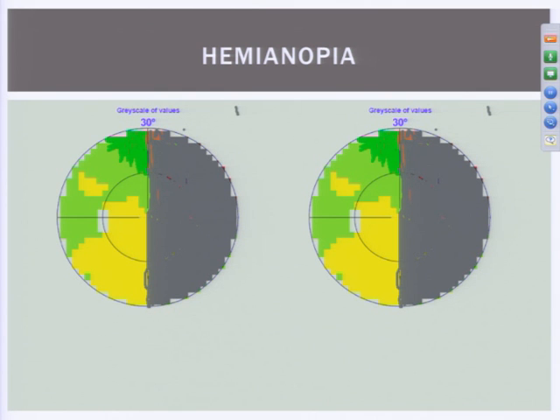Now, that would sound pretty straightforward. Why don't we just always do that for people who have strokes? The problem is that when the brain goes to fixate or use the vision, the brain will use the center zone, the area that we call the macula, and it'll basically negate the prism effect.